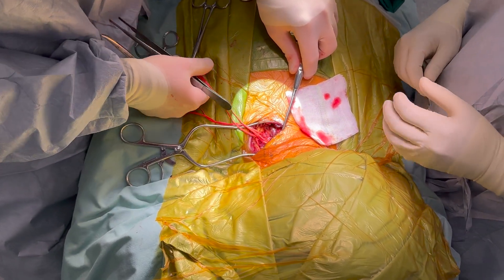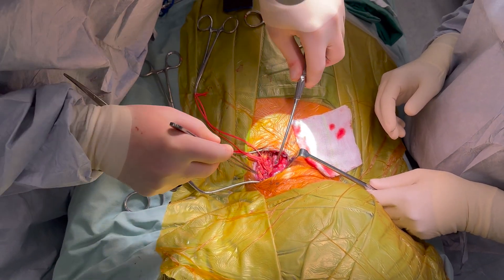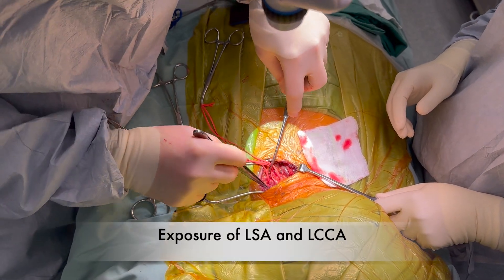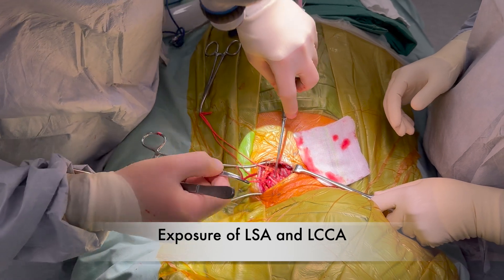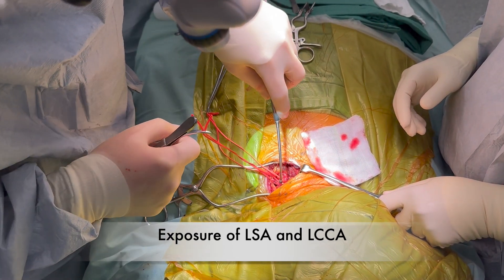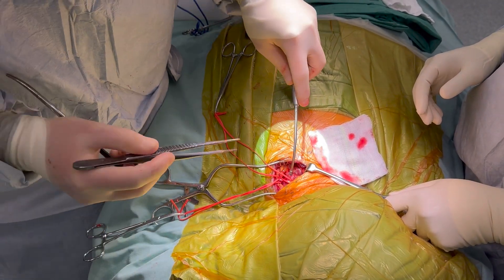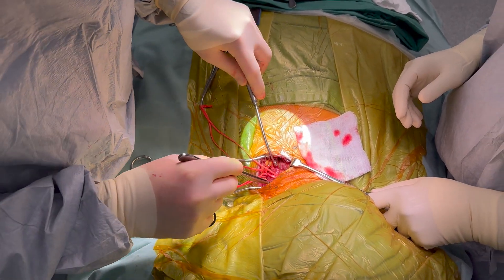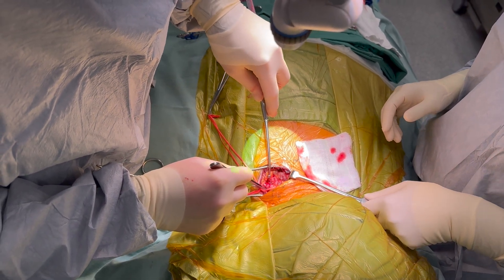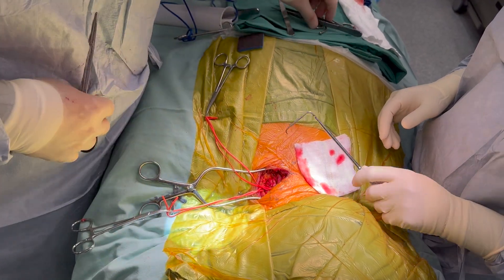This sling is on the phrenic nerve, which was dissected off the scalenus anterior muscle. Once the scalenus anterior is divided, the subclavian artery appears — you can see it here. To get to all of this, the area was covered with a fat pad called the scalene fat pad, which was dissected laterally. We're now ready to perform our anastomosis onto the left subclavian artery and left common carotid. I just need to expose the right common carotid, so I'll swap places.